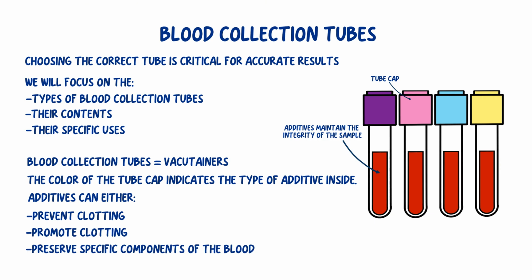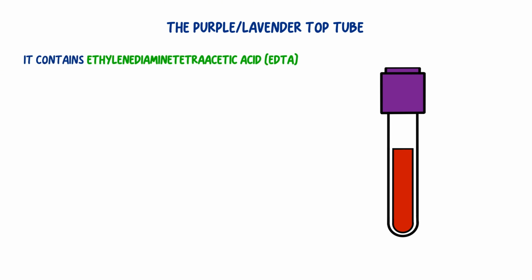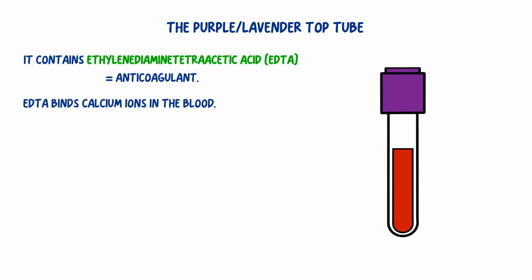Now that we've laid the groundwork, let's move on to our first type of tube, the purple top tube. The purple or lavender top tube contains EDTA, which functions as an anticoagulant. EDTA works by binding to calcium ions in the blood, a critical component in the clotting process. By removing calcium, EDTA prevents the blood from clotting inside the tube, ensuring that the blood remains fluid and that the cells maintain their shape. This is crucial for the accuracy of certain tests.